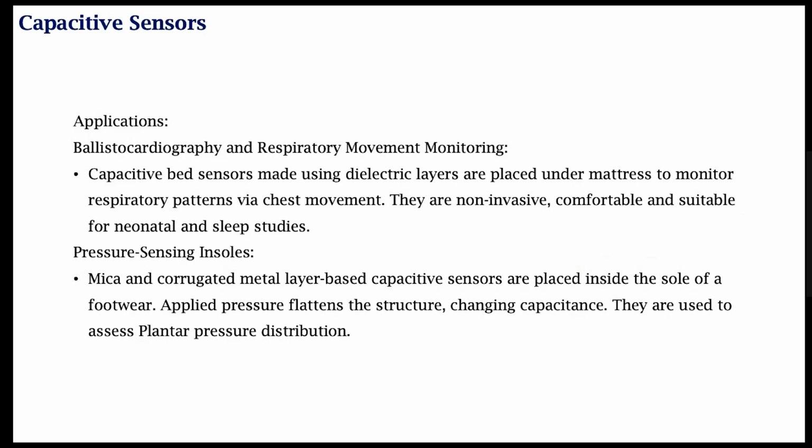Another application, again a critical application, is to use capacitive sensors to measure pressure distribution inside the shoe of a person. This has critical application in diabetes, for example. Diabetic foot is a huge problem that is still not well addressed in a country like India, which happens to be the diabetes capital of the world.